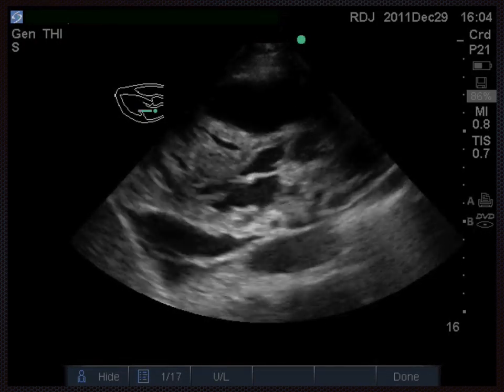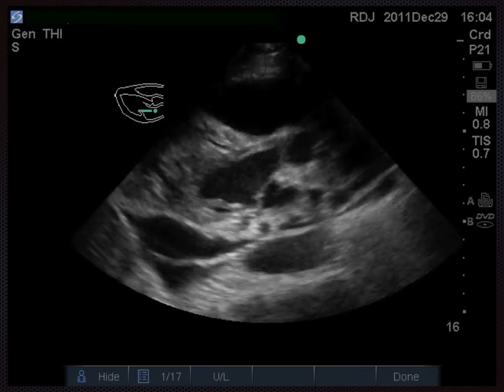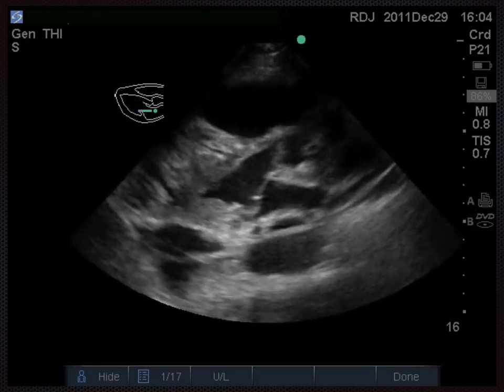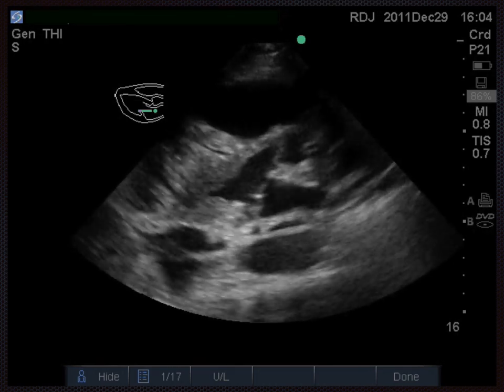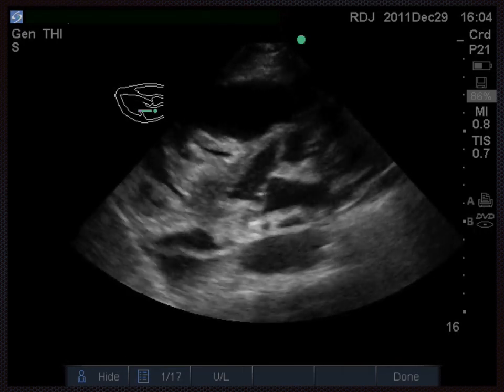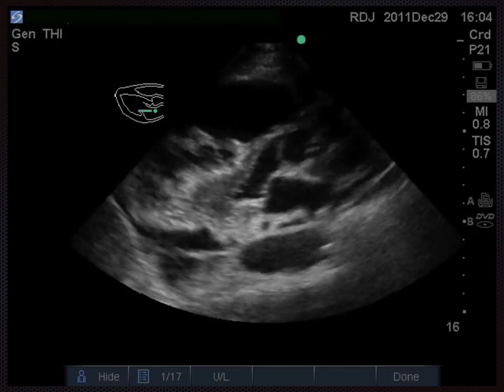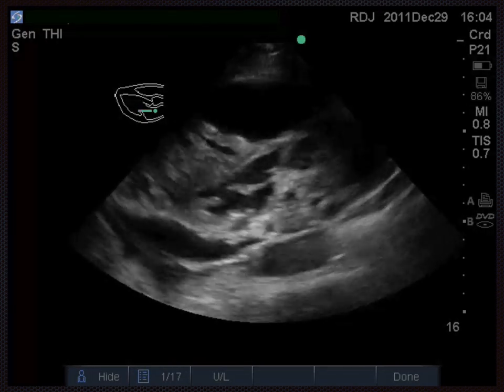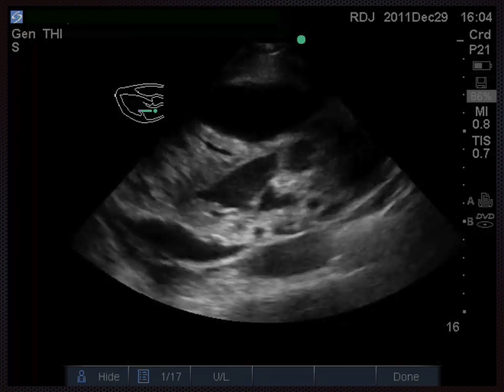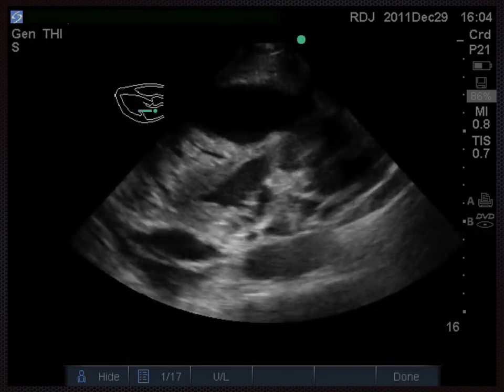You've been asked to try and save them. So you perform a bedside echo, and this is a view that you've got on the parasternal long axis. Now the pressure's on to really see, can you yield information from this that might help you in your resuscitation. So looking at it, it looks grossly abnormal. It doesn't look like the normal views that you've seen so far of the parasternal long axis. So let's use our system.